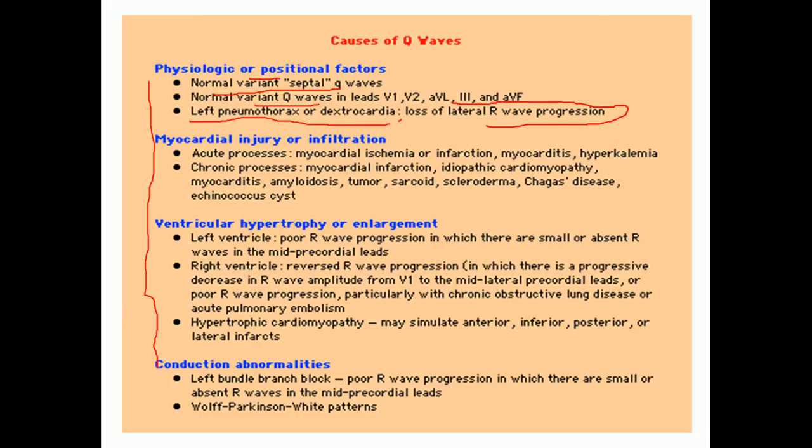You should remember, we will tell you later, that a poor R wave is an indicator of two things. One, once the R wave becomes poor, the relevant Q wave will be exaggerated. And secondly, a poor R wave indirectly represents a Q wave that is an indicator of subendocardial infarction or subepicardial infarction. We will tell you later. As we said, it is possible to produce loss of R wave progression by normal states also.